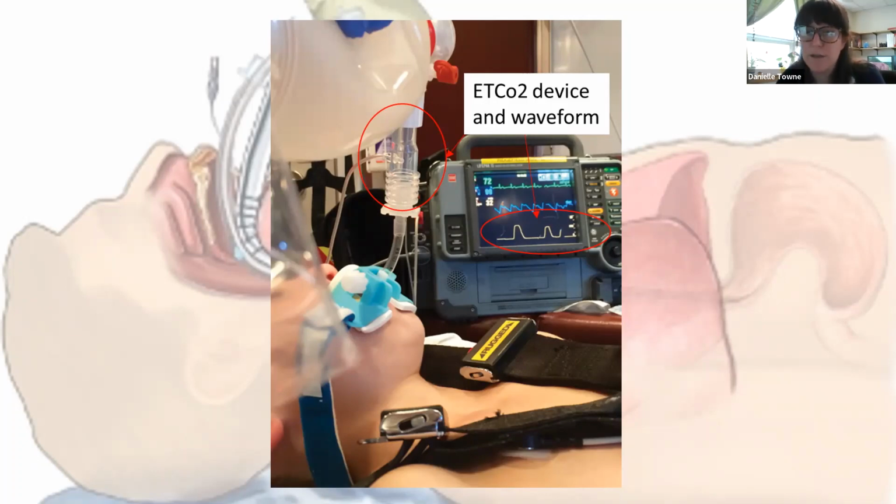You can see right after an intubation, it opened up at like 60, and you're thinking, why is that? Well, when we made them apneic for the intubation by sedating and paralyzing them, we took away their ability to exhale, allowing CO2 to build up in their system. So if that intubation attempt took a little longer and we didn't bag in between, you can have a buildup of CO2 in those lungs. As soon as you put that ET tube in and start to bag, and they are able to exhale again, you're going to see all that CO2 come out. That number should come down with proper and really good vent management.